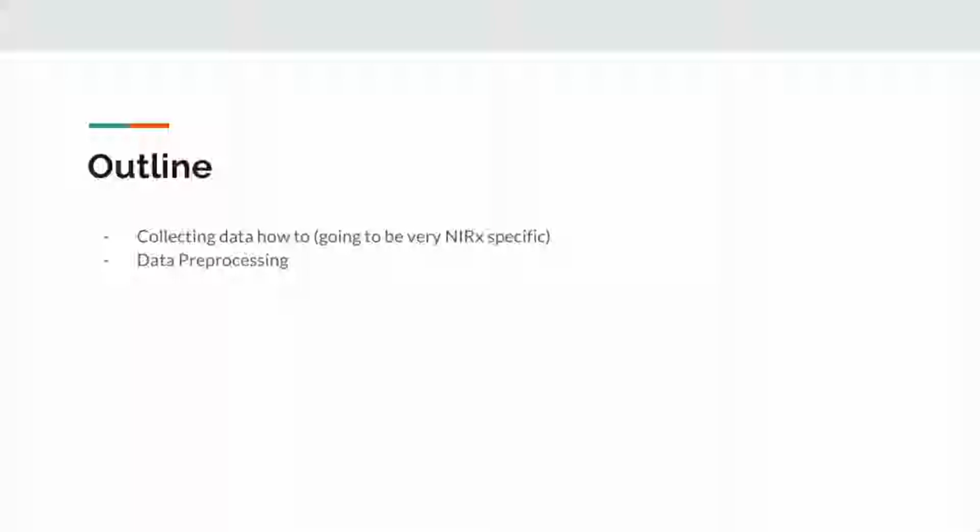And then we'll talk about what goes on in fNIRS data pre-processing. We won't do the pre-processing today and all the data handling for that. We'll do that first thing tomorrow, mostly because I still don't have the code posted yet. But this will give you an idea of why we're making certain choices in our code. All right, there's the start of our operating pipeline.